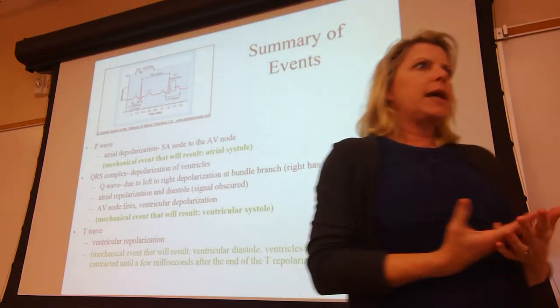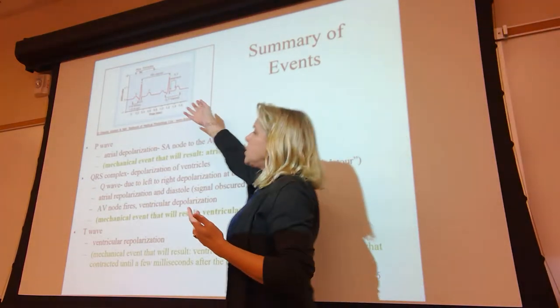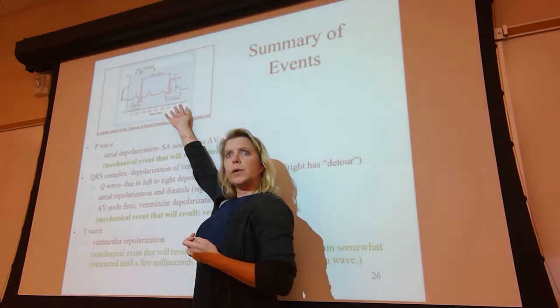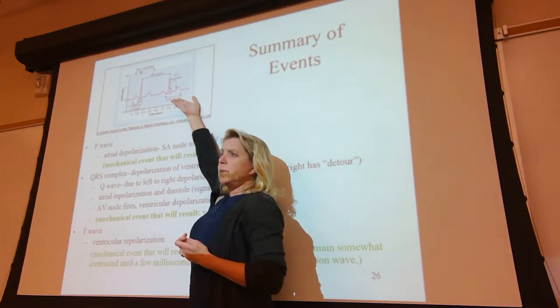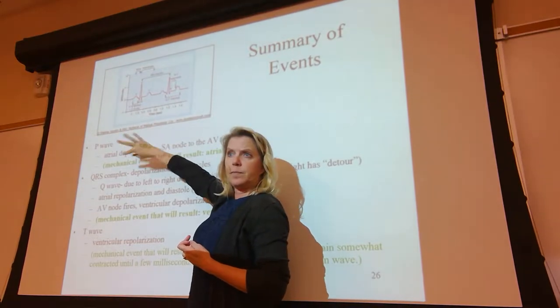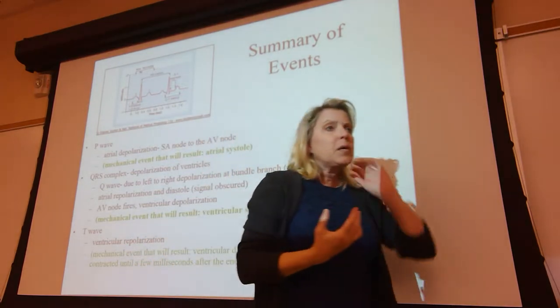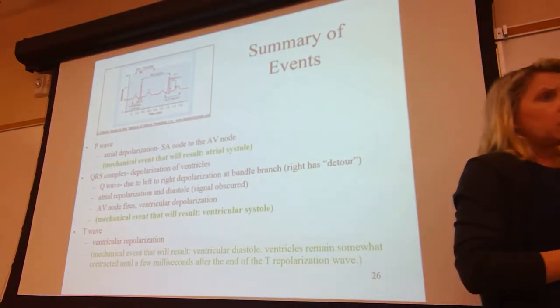And there was a question I asked you, what would the EKG look like if someone strapped lead 2 on backwards? And you all said this picture would be flipped, inverted, the mirror image. So that's AVR, basically. So P wave represents atrial depolarization.